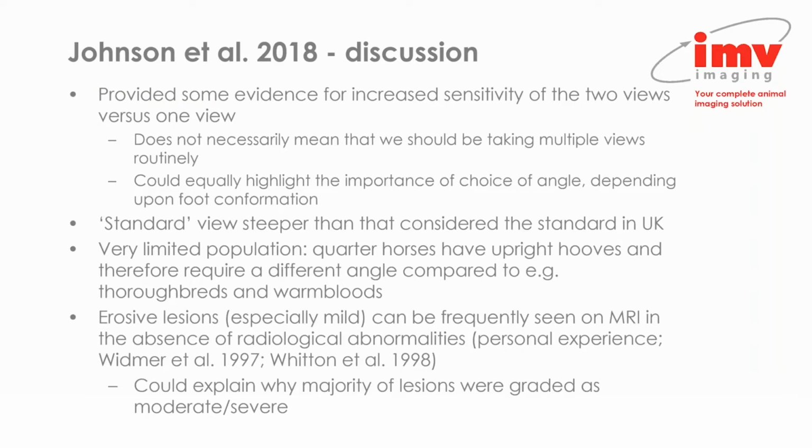It did provide, however, some evidence for increased sensitivity of 2 views versus 1. However, that does not necessarily mean that we should be taking multiple views routinely. As previously mentioned, it could equally highlight the importance of the choice of angle, potentially depending upon foot conformation.